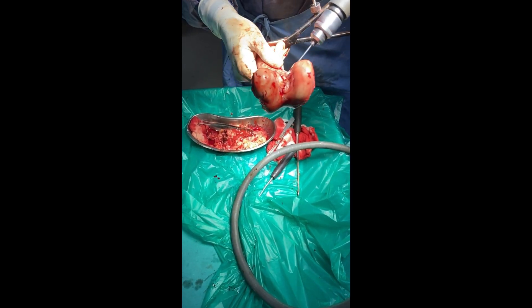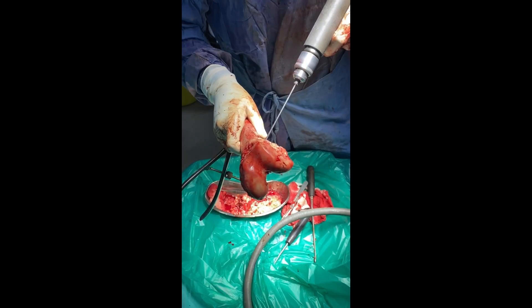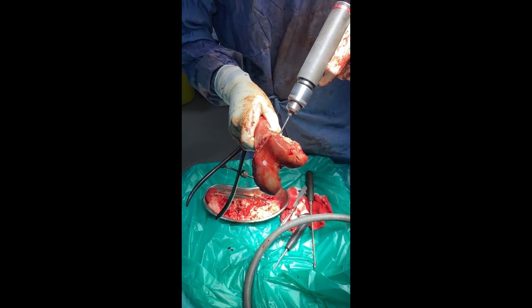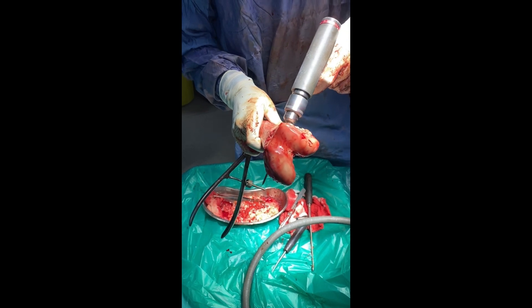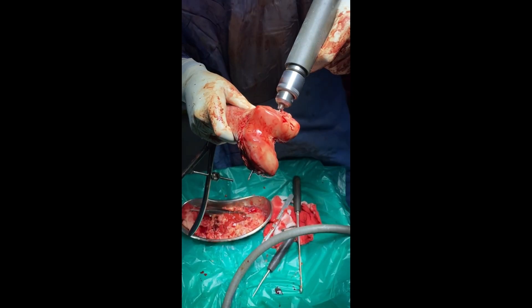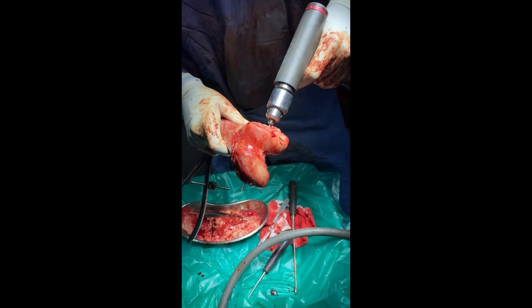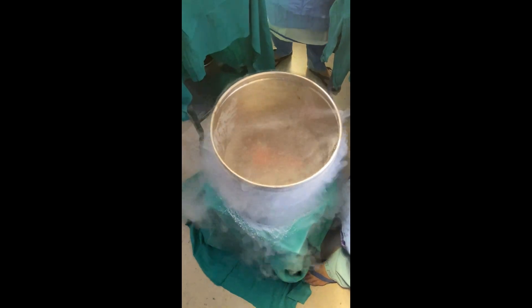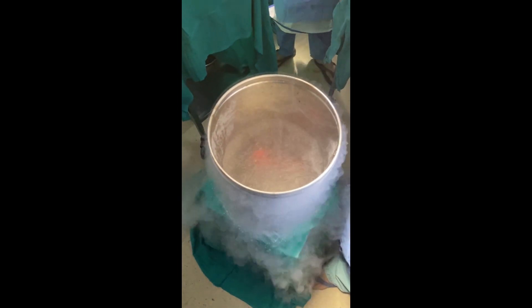Multiple holes are created into the distal femur bone using a drill. The purpose of these holes is to allow passage of liquid nitrogen and prevent the risk of fracture. The bone is then dipped into liquid nitrogen at minus 180 degrees for 20 minutes, and then thawed to room temperature.